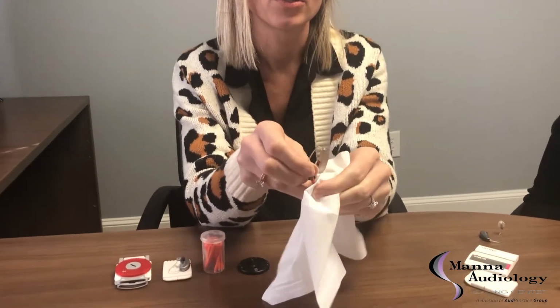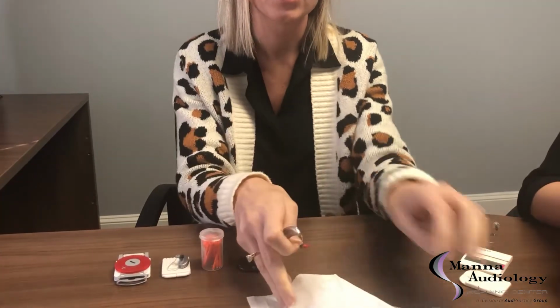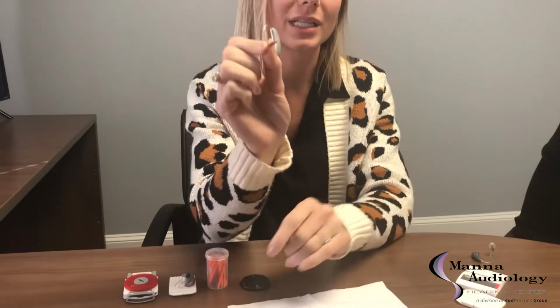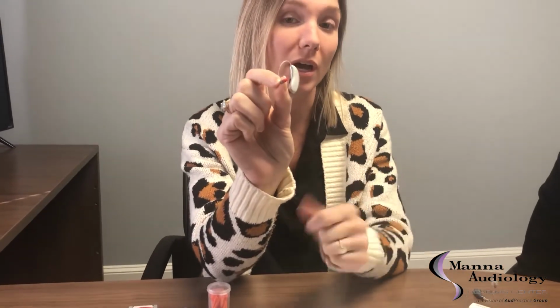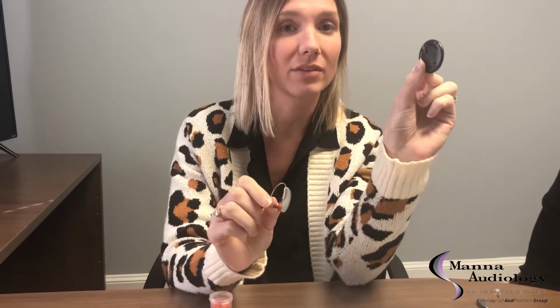Okay, so the next hearing aid that we're working with is a Phonak hearing aid. So very similar in terms of getting the rubber dome off. Take a tissue, you're gonna squeeze that dome and it just pulls right off. So this is going to look a little bit different than the Oticon hearing aids. So you actually have a little disc here.